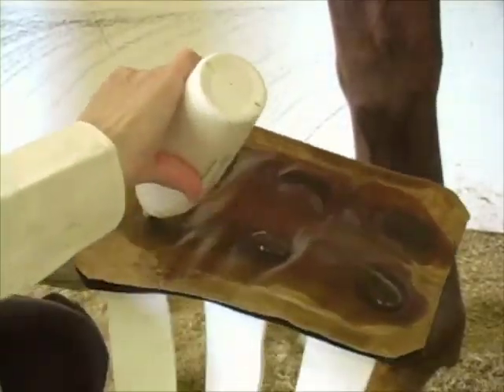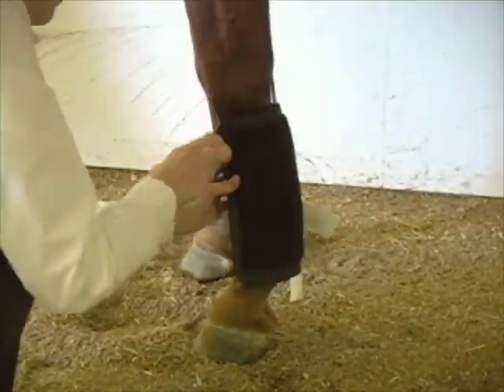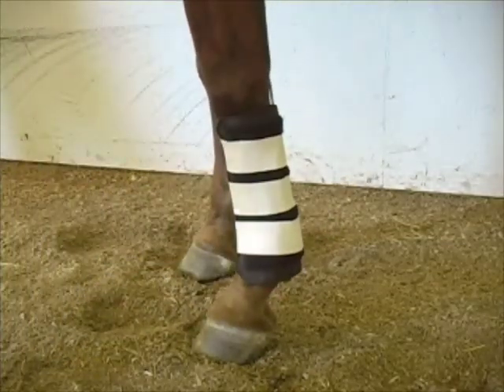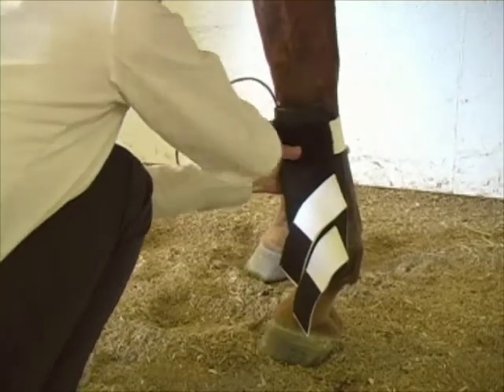Position the center of the pad on the back of the leg for flexor tendon and suspensory ligament therapy. Position the center of the pad on the front of the leg for extensor tendon therapy. For edema therapy, place the majority of the electrodes directly over the swelling.